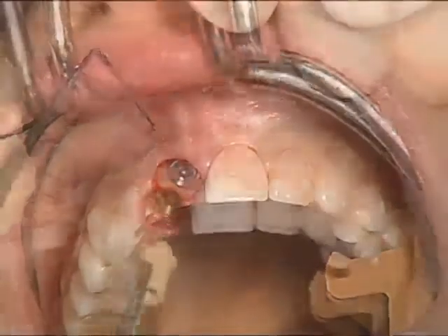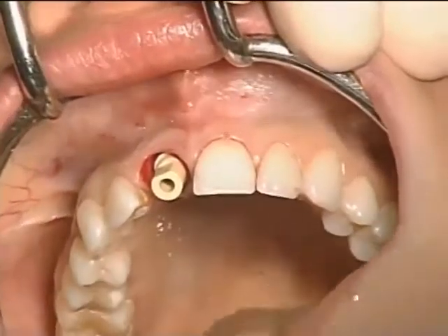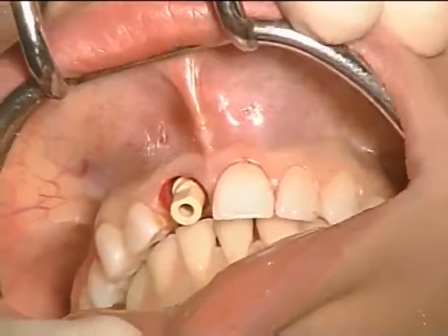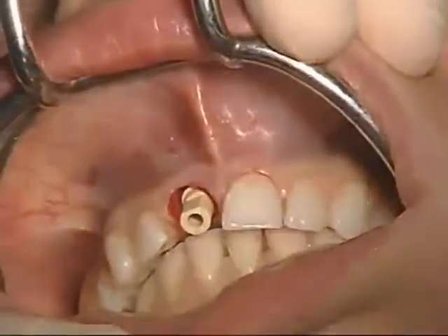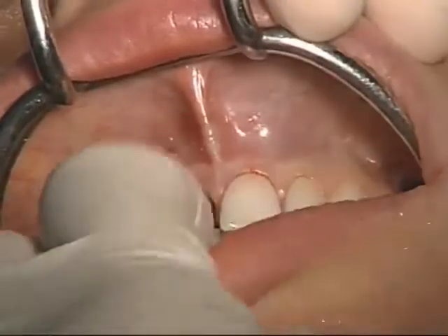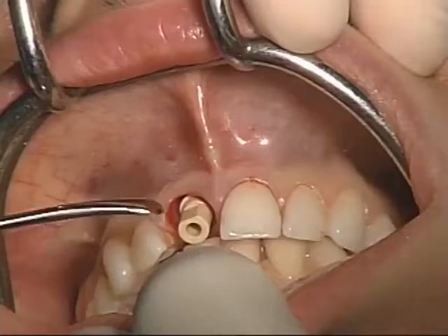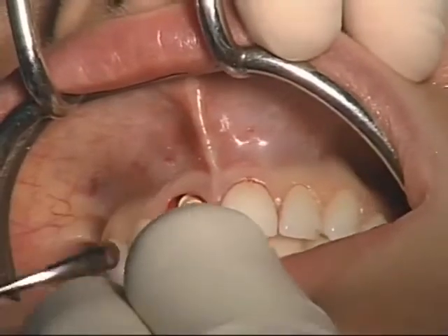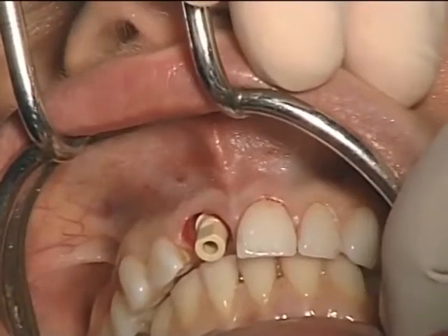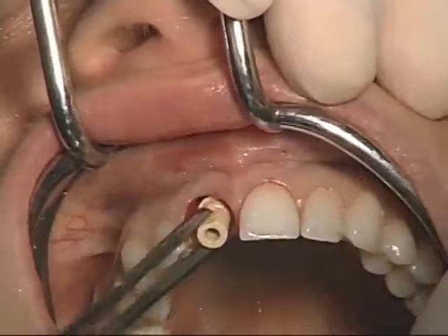Prior to retrofitting of the temp stent, we will first try in our HLPT4 provisional abutment from Zimmer. We will check our occlusion, and from this we get parameters of how much preparation we have to do to the abutment out of the mouth. And this will be what we'll be retrofitting back to the temp stent after preparation is done. So we'll have to shave from the facial and palatal, and then occlusally we'll have to take the temporary abutment more in the apical position.